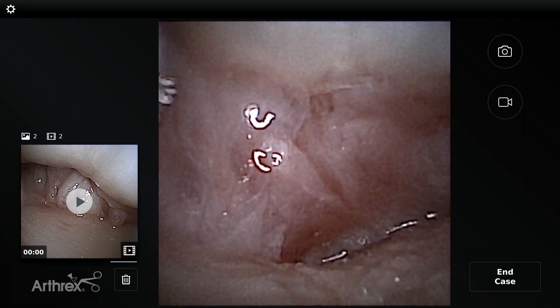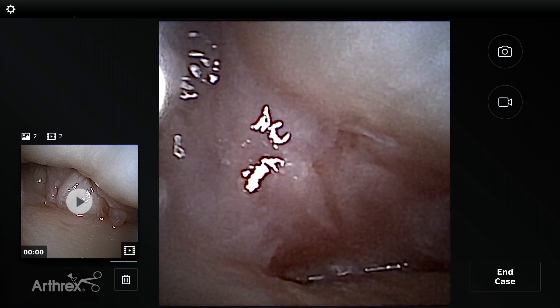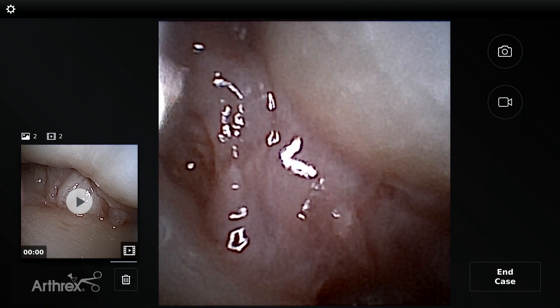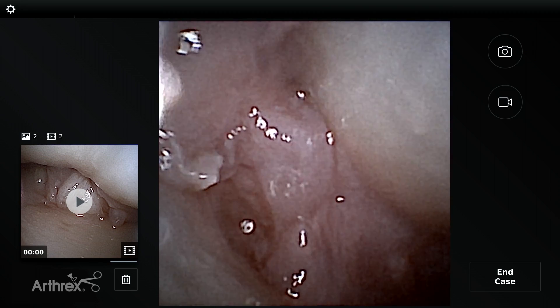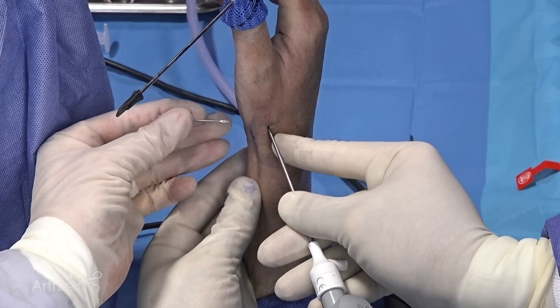Remember when you get arthritis, the tendency is to get palmar osteophytes, and this is the area we need to debride if we want to do an arthroscopic synovectomy using the nanoscope technology. You can see it's essentially a 12-gauge needle in a very tight joint. You can see this joint has some arthritis in there, and now what we can do is use the small joint shaver system.